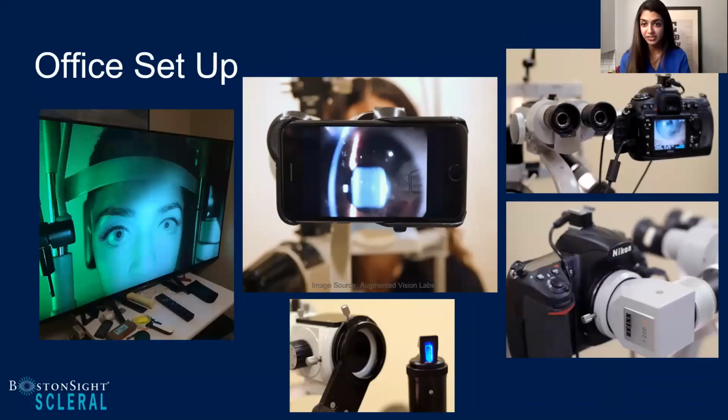So we talked about office setup, and as you all are familiar, I travel quite a bit. So in Buffalo, I work in an ophthalmology setting, and we have a main hospital location and 3 other satellite locations. And so I wanted to really highlight to the audience what my office setup looks like. And to be frank, it's different in every office. So in our downtown location, we have an imaging suite, and we put in orders for slit lamp photography. So I am at the mercy of our technical imaging staff who take the images for me. There I have to really be specific and communicate how I want the images, what I want the images for. So really communicating and training your imaging staff, if you work in a setting like that, is important.